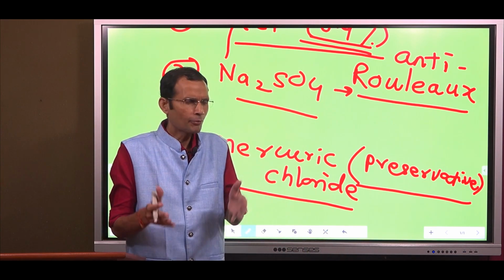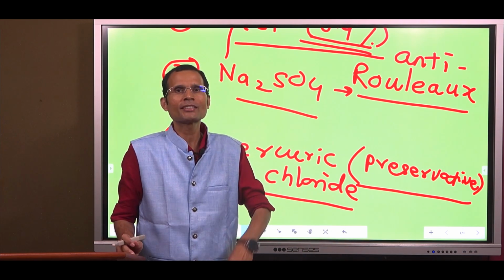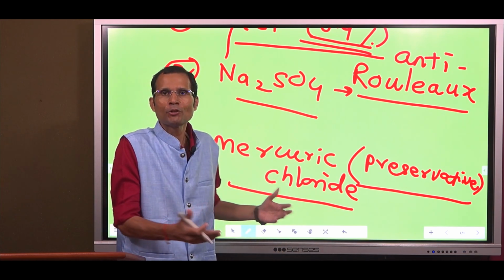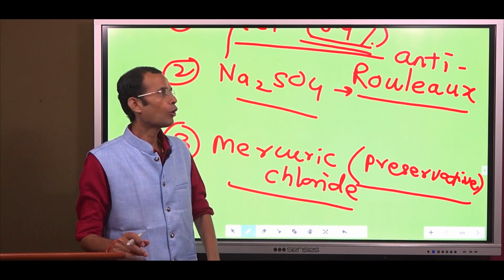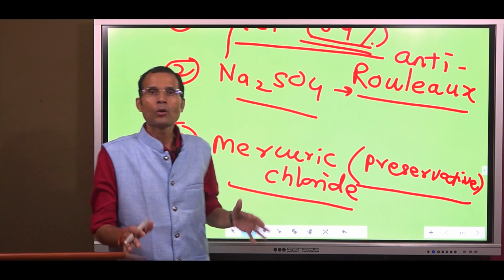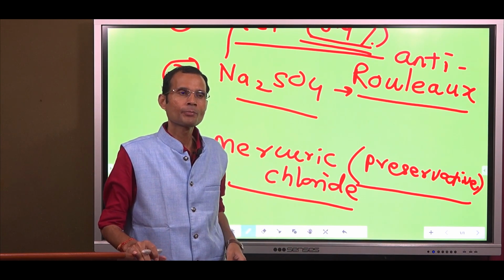Well, we don't need a preservative for that. We are going to use it only for 5-10 minutes and going to discard it after that. So we don't need a preservative. Then preservative of what? Preservative of the entire solution. Look, we make the solution for the entire batch of 50 students.